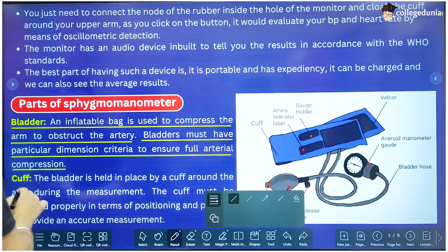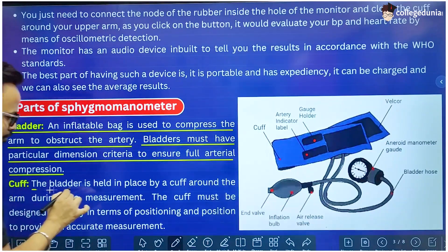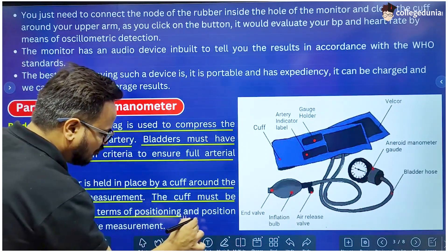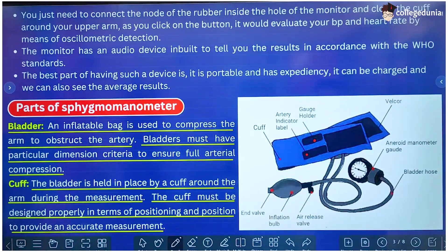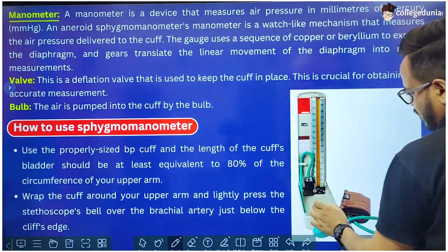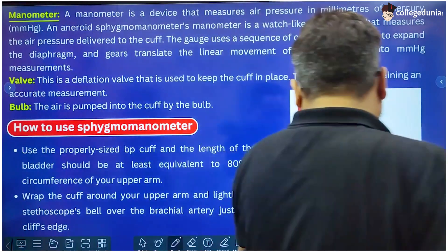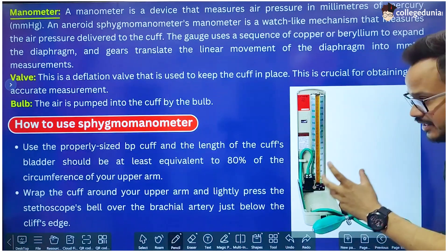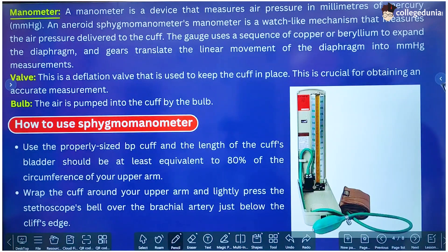The bladder is inside the cuff — the blue part — and that is called the cuff. The bladder is held in place by the cuff around the arm during measurement. The cuff must be positioned properly to provide an accurate measurement, so positioning of the cuff on the arm is very important. The next part is the manometer, which in the mercury type is the mercury column — anything which reads the pressure is called the manometer. Next is the valve and the bulb, which is used to pump air into the cuff or bladder to achieve pressure. When the desired pressure is reached and it needs to be released, the valve is used to let air out of the bladder to decrease the pressure.